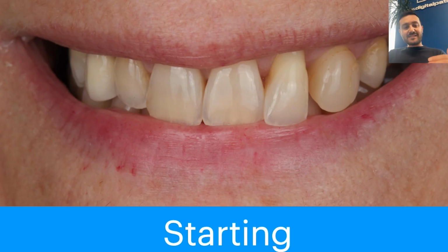The smile appears asymmetrical, not straight, and there's an evident discrepancy in both the color and the position of her teeth. From a purely diagnostic point of view, orthodontic treatment would be the ideal first step. But the patient was very clear. She doesn't want a long or complex treatment. She wants to achieve the smile she always dreamed of, and without waiting months or years.